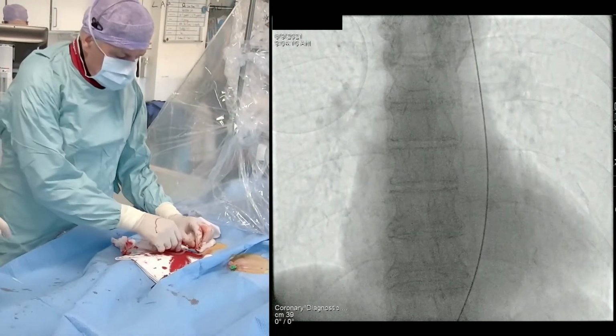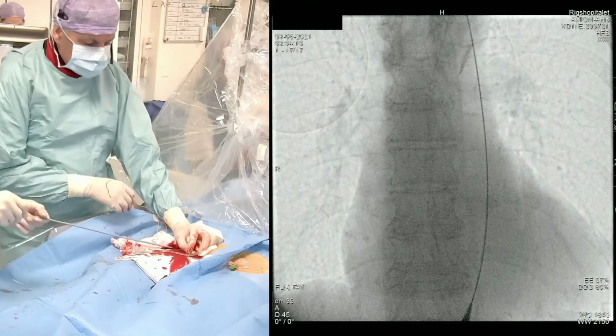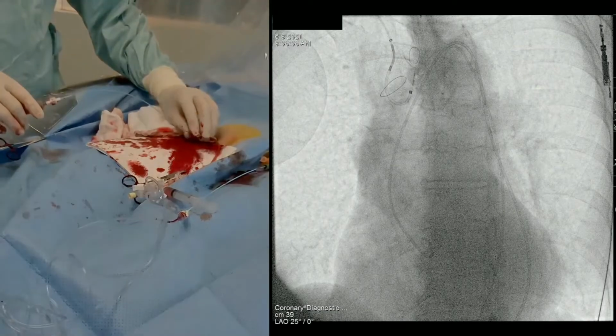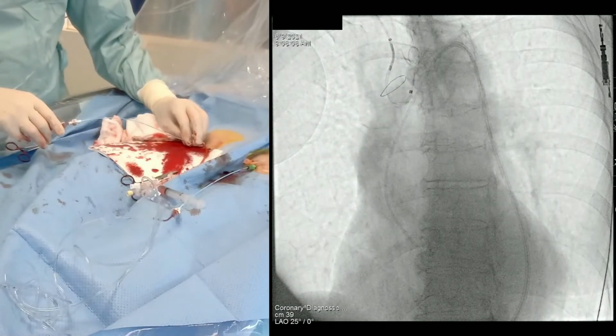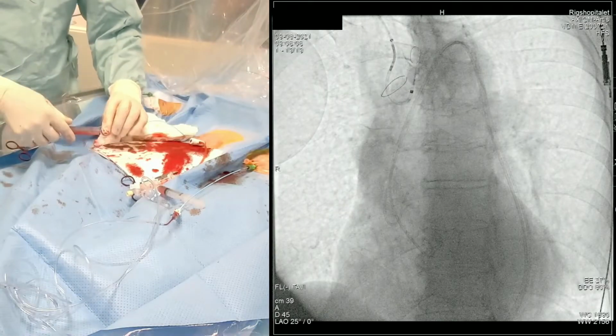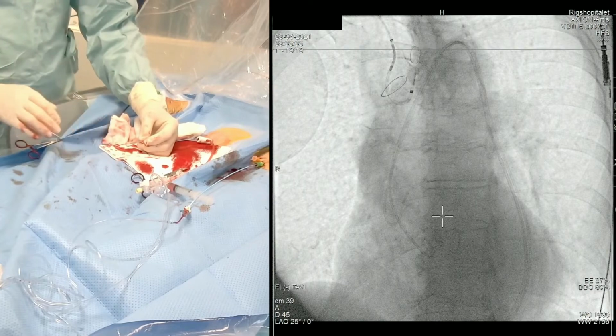So push that up here, and we can take the AL1 up, like a straight wire. And then next, of course, will be to try to cross the valve here. Okay, I'll zoom a little bit in. And I need a straight guide wire. Yeah, it's coming.